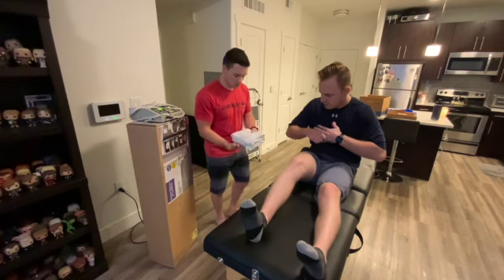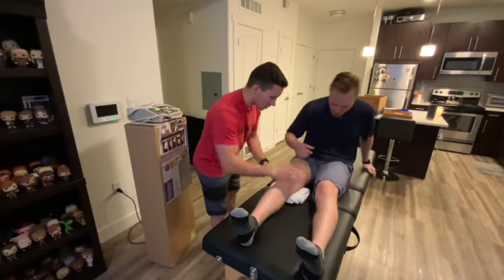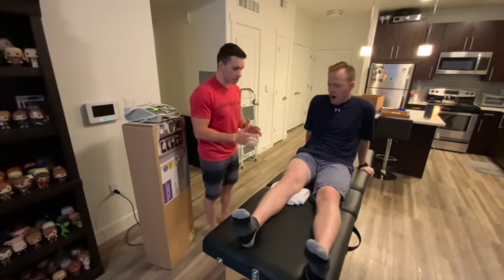Yeah. Okay, so I just want to hurry and put these towels underneath here because I noticed, after we did some range of motion, that you're lacking a little bit of extension in your knee, so just to make you more comfortable there.